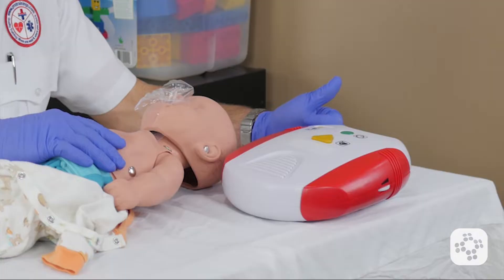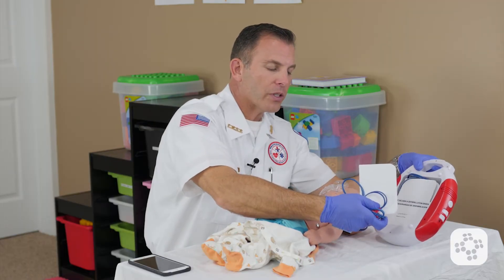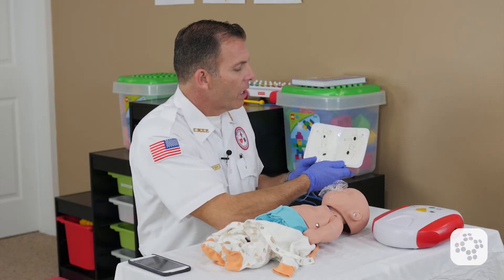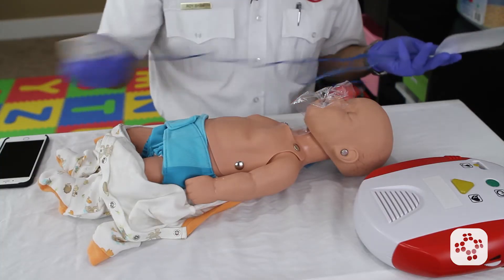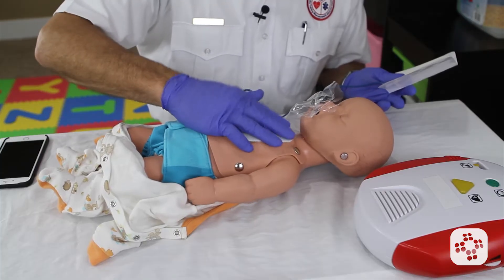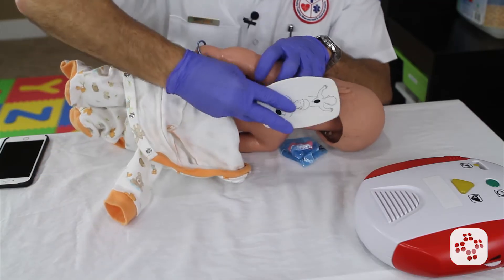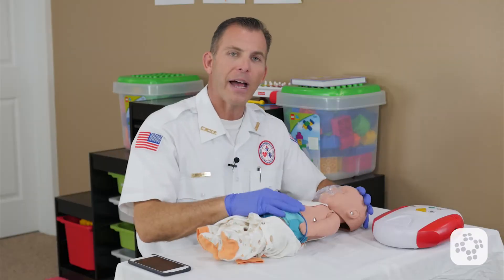The AED prompts us to attach pads firmly to the person's chest as shown. As we turn the AED over, it has two sets of pads: the pediatric size pads and the adult size pads. In this case, we obviously want to use the pediatric size pads. When we open up the pads, you'll see a diagram showing where to place them. We take the first pad and place it right on the center of the chest, making sure it's stuck well and not peeling up. Then we take the second pad, carefully rolling the baby onto its side while protecting its head and neck, and place it in the appropriate location between the shoulder blades on the center of the back, then roll the baby back onto its back.